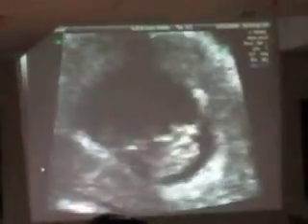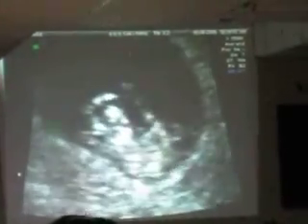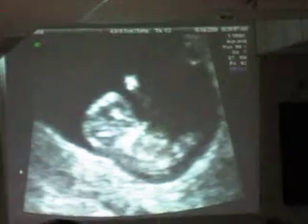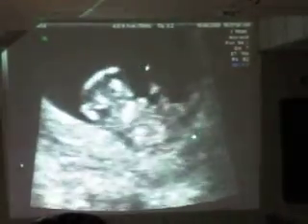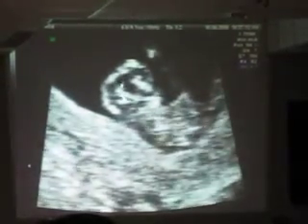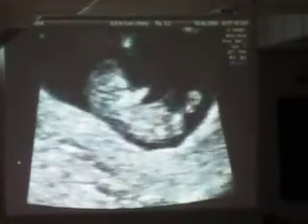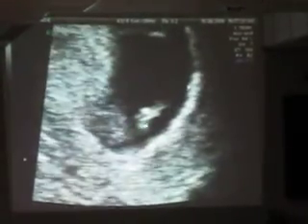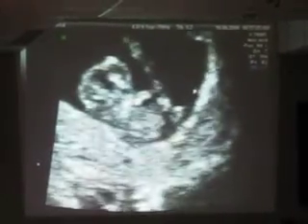Now see the amount of zoom she has done, then we're able to get much better details. At this stage, doing a transvaginal scan will give you much more information about the fetus. You can ask her to empty her bladder. You can see the limb buds moving there. The upper limb is here, lower limb is here. And you can see the intracranial contents. The brain cleavage has just started. Then we'll look at this transvaginally in a better fashion. The whole extent of the lower limb is seen. Right, any other questions?